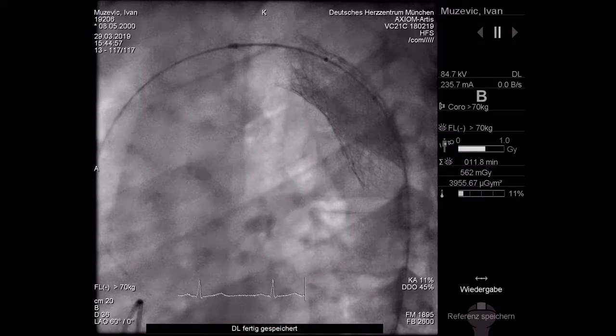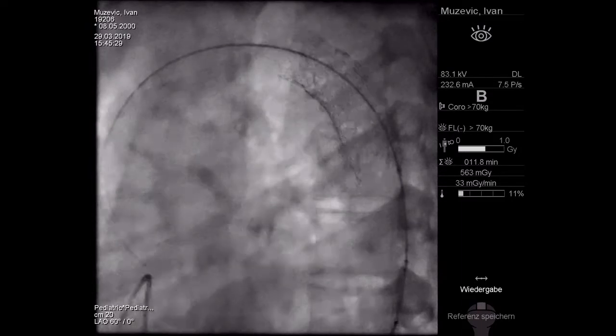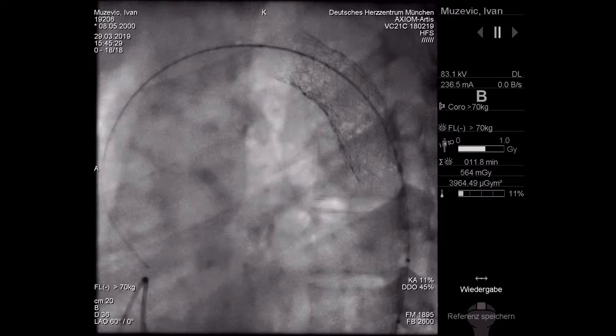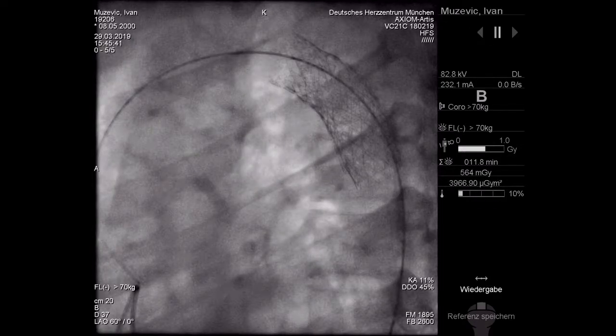So hopefully we can see the pressure. Okay, so we take the balloon out. Peter, what does it look like now? Jacques? Yep. What did you do different this time? I took all the force I had and tried to do the dilation. And I really said to Dr. Georgiev, wow, go. And probably this was the decisive difference.